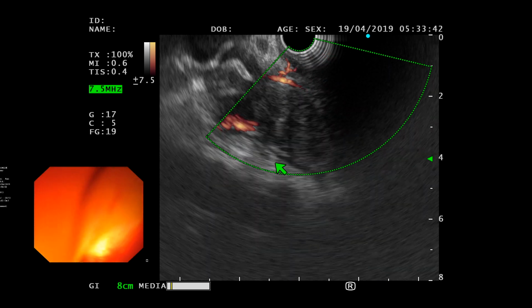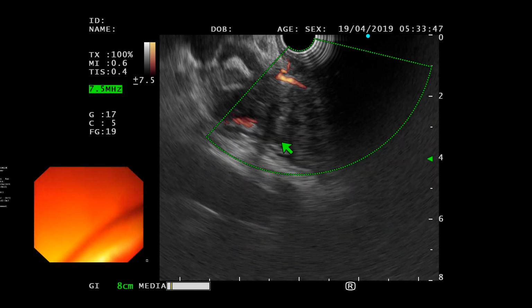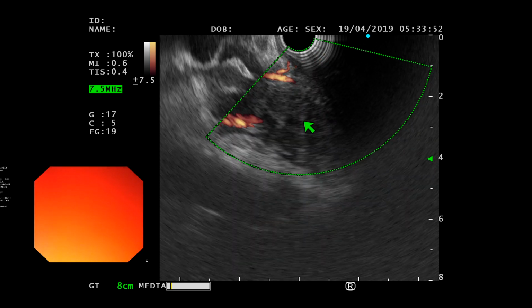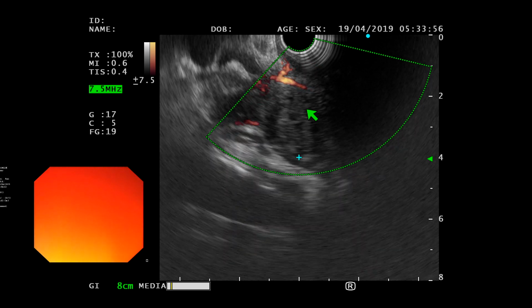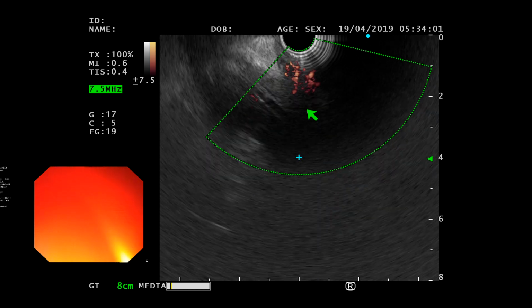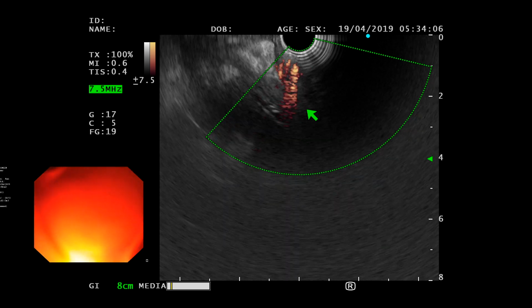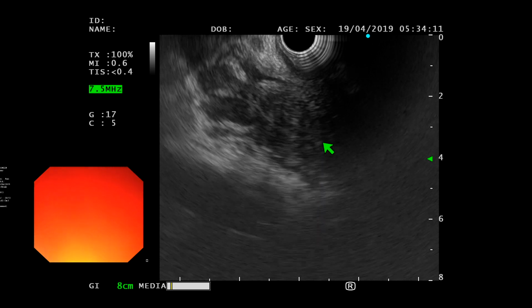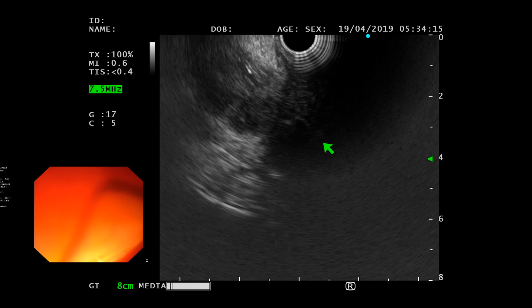So trainees, in early training, I think it's really important to put a Doppler on before you do it. Although this vessel here, I'm not really too pushed even if I go through this. That's okay, it's a very small one. But you should really put the Doppler on. At the early stages of your training, it only adds like 5 seconds, so I think it's worth doing every time. Yeah, true, agree. It adds a lot more to your safety, so do it please. Make it routine.